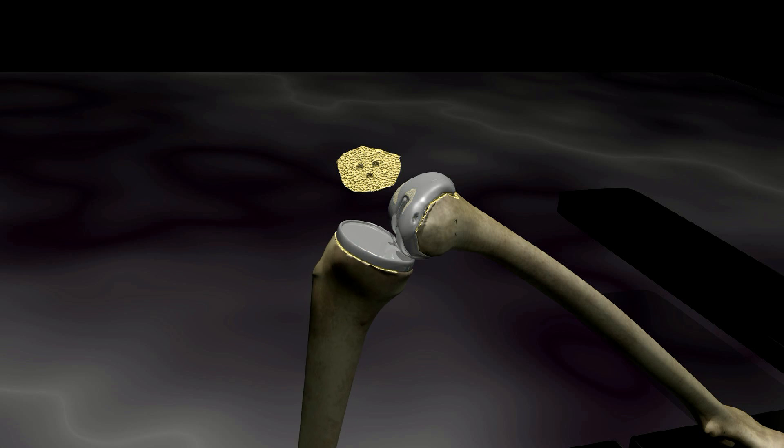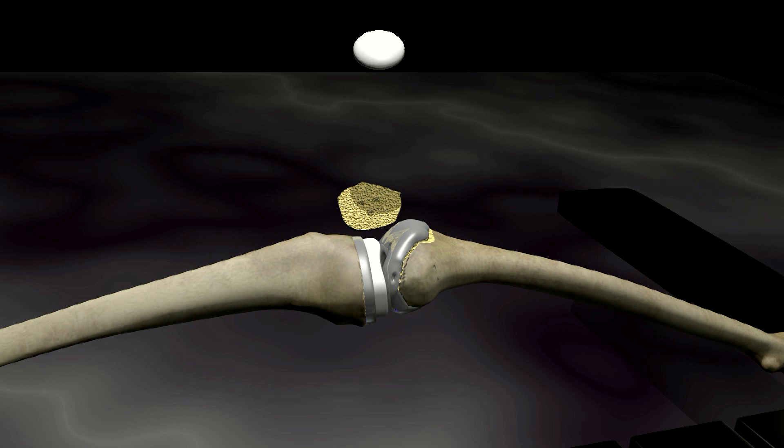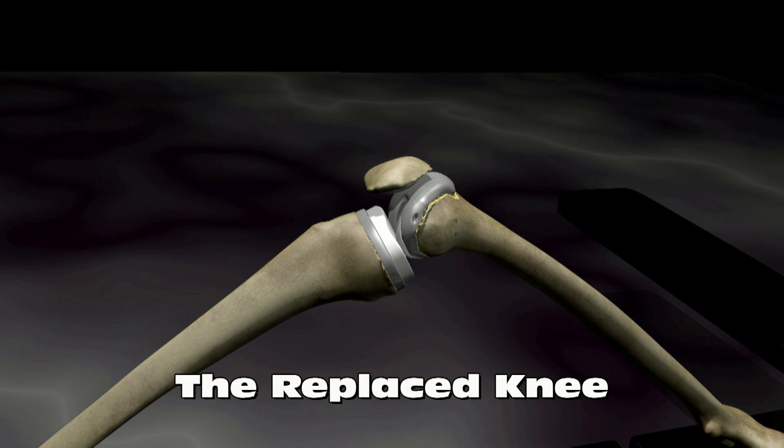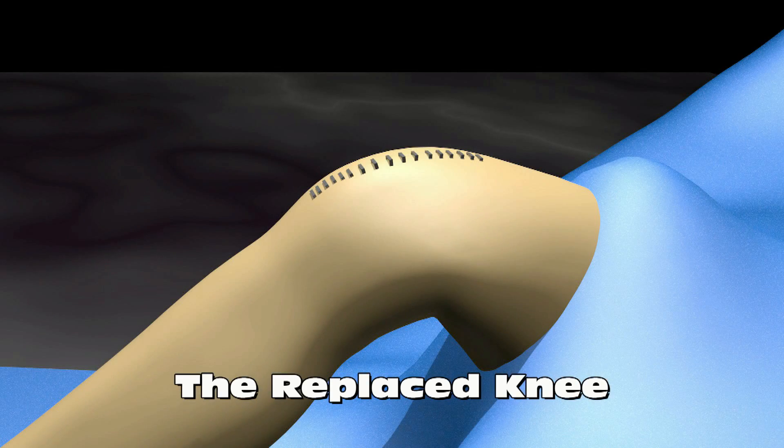When the cement has dried, the joint capsule is sutured closed. Sutures or staples can then be used to close the skin.